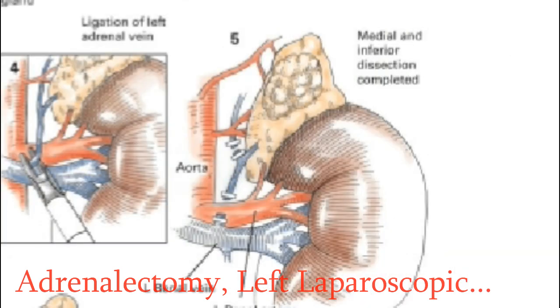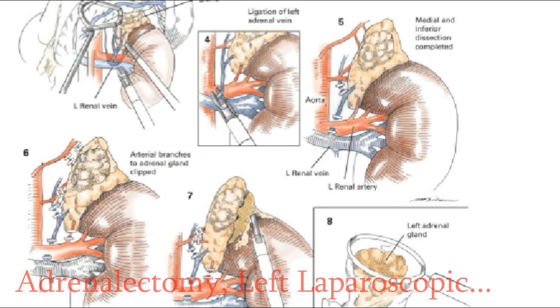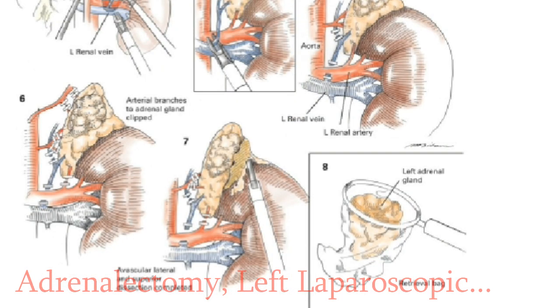Once the gland is identified, dissection begins with the ultrasonic device along the inferior border of the gland. The adrenal vein is dissected so as to visualize its entire course. It is doubly clipped on the patient's side and divided. The ultrasonic device is used to dissect around the adrenal gland. Clips may be used to secure smaller blood vessels. Small arterial vessels enter the adrenal gland like the spokes of a wheel. In some patients it is necessary to dissect the entire lateral border of the adrenal gland in order to mobilize it and retract the gland superiorly, thus permitting identification of the adrenal vein.